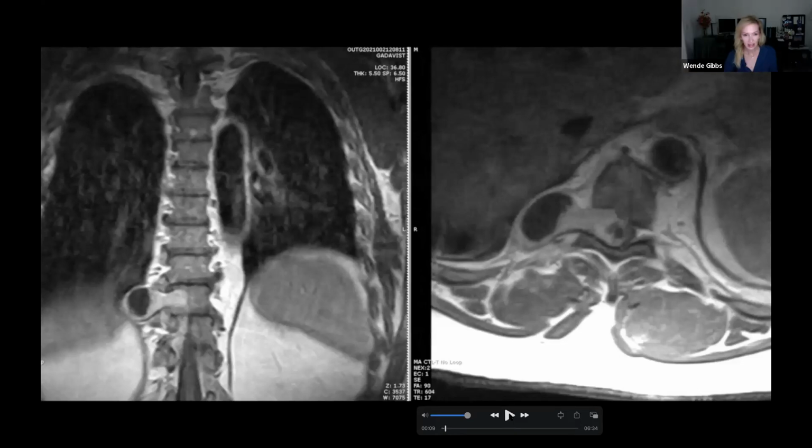All right, so it looks like, what have you got here? What kind of weird sequences? This must be a T1 post-contrast, I think, on the right axial, right? Because you got bright fat, it's not fat saturated. But you have enhancing tumor coming out in widened neural foramen, so that's a long-standing process, like a nerve sheath tumor. It's got some heterogeneous signal in it, though, kind of out peripherally, which makes me think it's got maybe some more aggressive features.